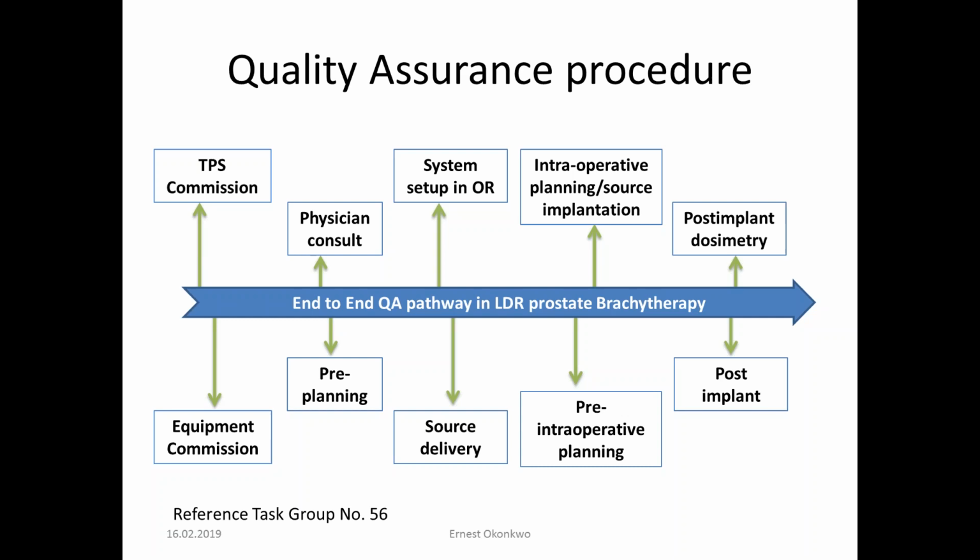The post-implant dosimetry is mainly, when do you want to do the post-implant dosimetry? Do you want to do it immediately the next day after the implant, or do you want to do it several weeks after the implant? What are you taking into account? Are you taking into account the trauma that was caused onto the prostate? Because the needles that are being placed through the perineum into the prostate, they cause trauma, making the prostate swell. So when do you want to really do your post dosimetry, so that you can be sure of the quality of the implant that was done?